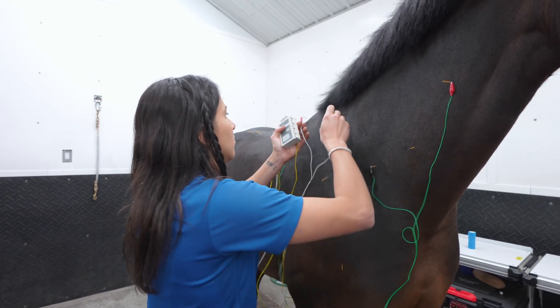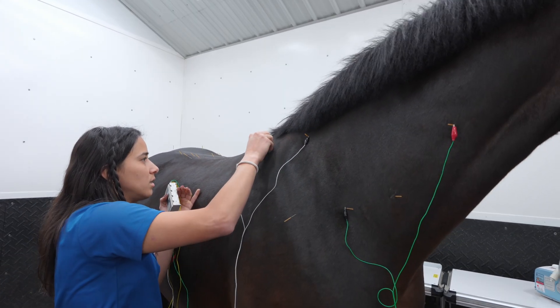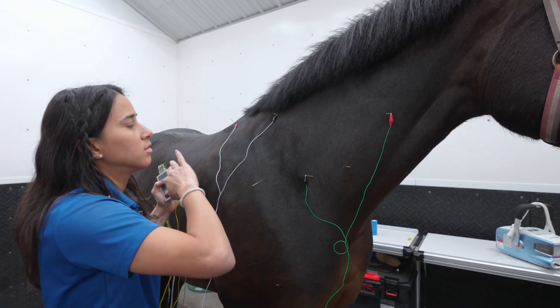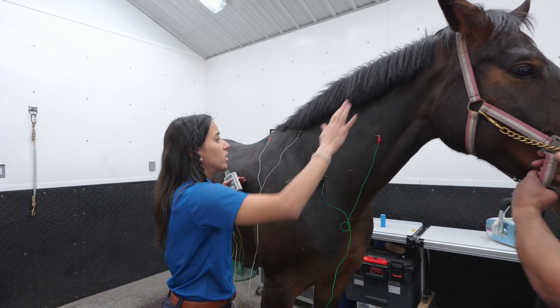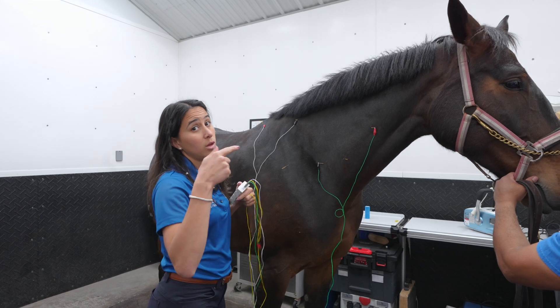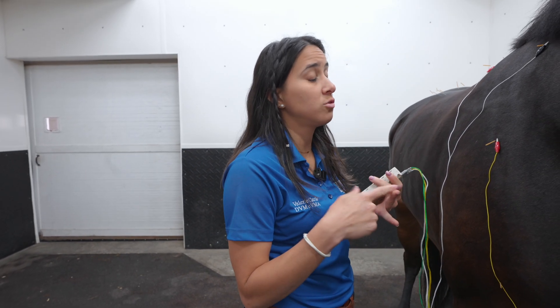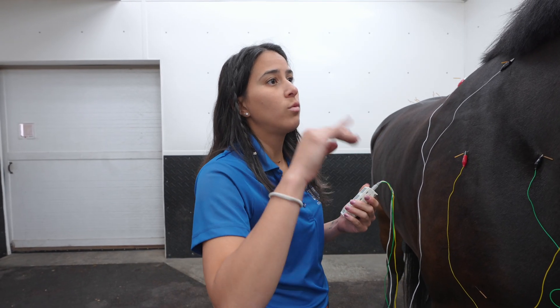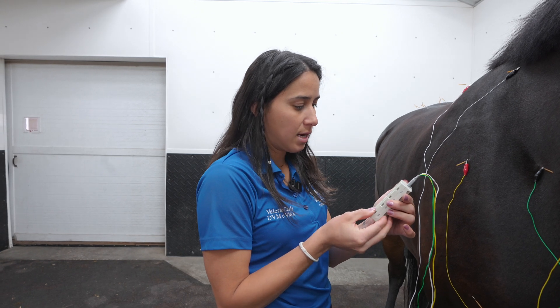We can do one side at a time or two sides at a time. Right here I am placing the electrodes that will release the electricity through the needles. Since I felt a lot of muscle stiffness and knots on this area, I want to start on the neck region and a little bit on the scapular region, doing one side at a time. This is going to be on for around 10 minutes, then we'll do the other side. There are specific meridians we're following — depending on the meridian is what nerves and muscles you're targeting. So if we want to treat the neck, we follow the meridian that goes through the neck and some other points that will help the neck region relax.